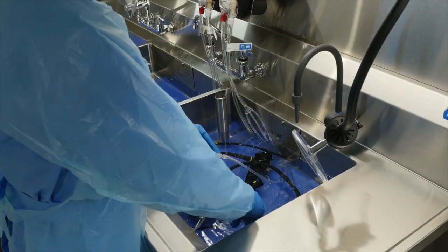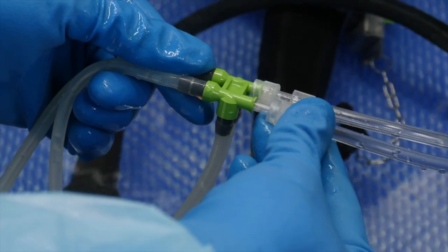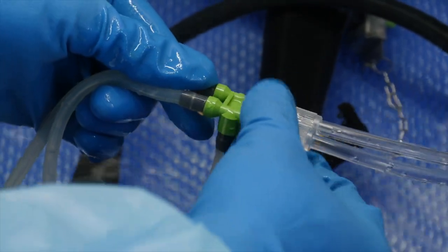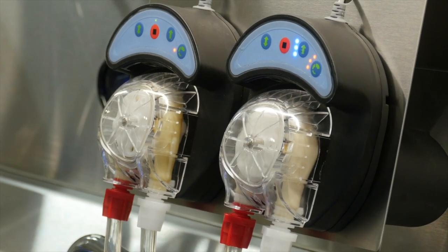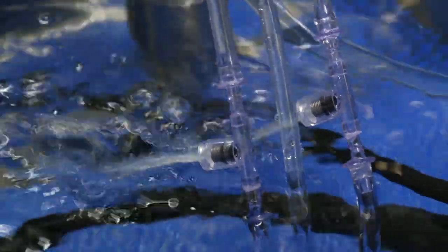Once the exterior and interior channels have been manually cleaned, connect the FlexiPump independent flushing system to injector and auxiliary tubing to flush channels. The FlexiPump ensures copious flushing with the proper amounts of cleaning solutions. Additionally, pressure relief valves protect the delicate interior channels of scopes during the flushing process.